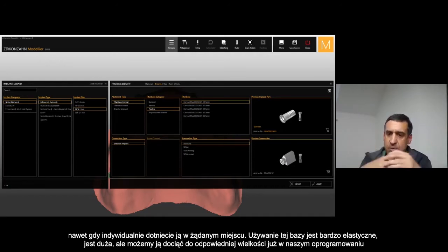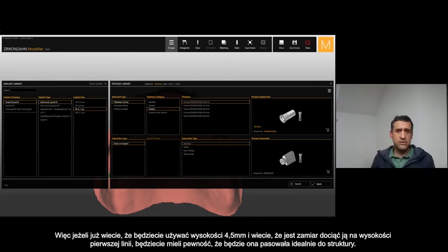These T-bases are really flexible because they come really large, but you can also cut them at different levels, and directly in the software — once you select, for example, 4.5 and you know you have to cut at the first line — you cut the T-base and it will fit perfectly inside the framework.